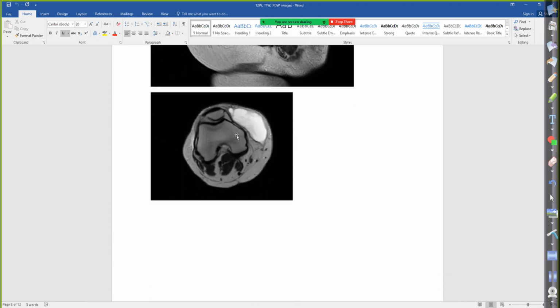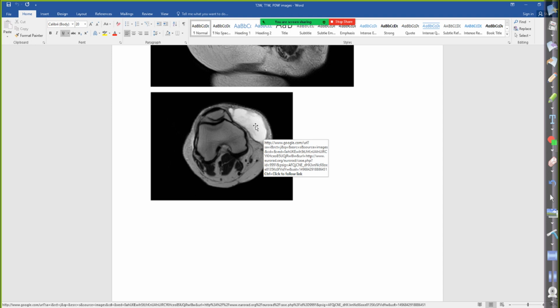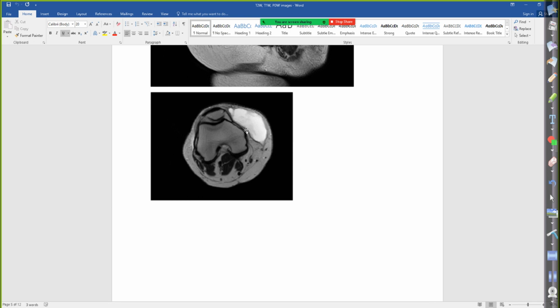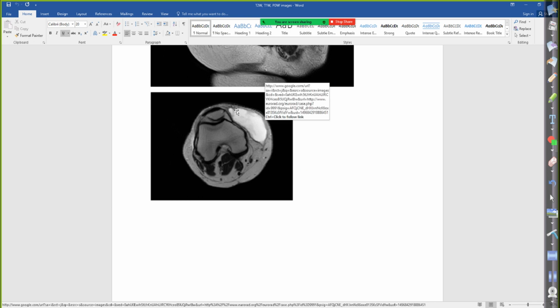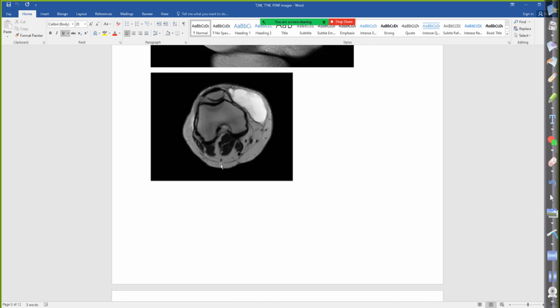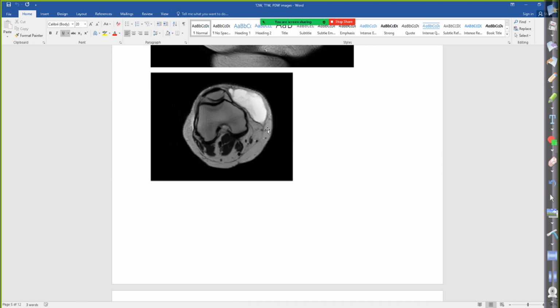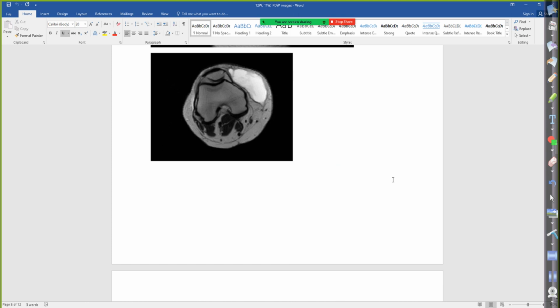And then the MSK, this is synovial fluid. If something happened, with a lot of edema, they'd have a big sac of edema from swelling. But that just hints at T2 weighted. Once again, if we didn't have that, we couldn't actually see any synovial fluid in the joint space. Go to the muscle, and the muscle is very dark. This is all subcutaneous fat.